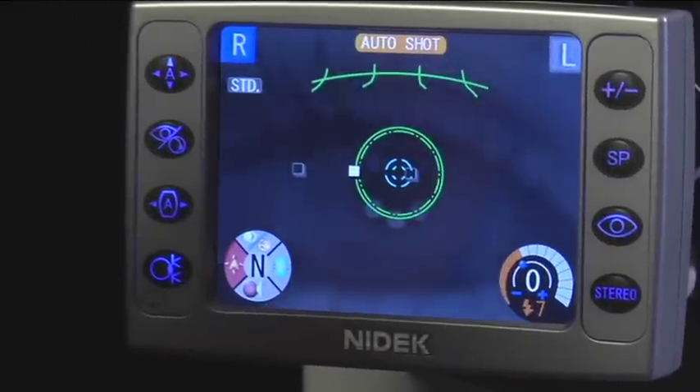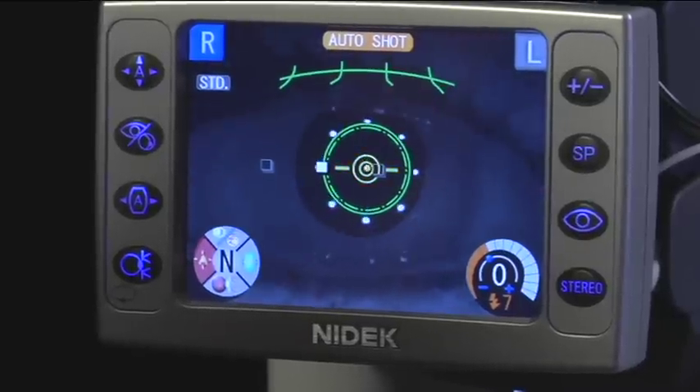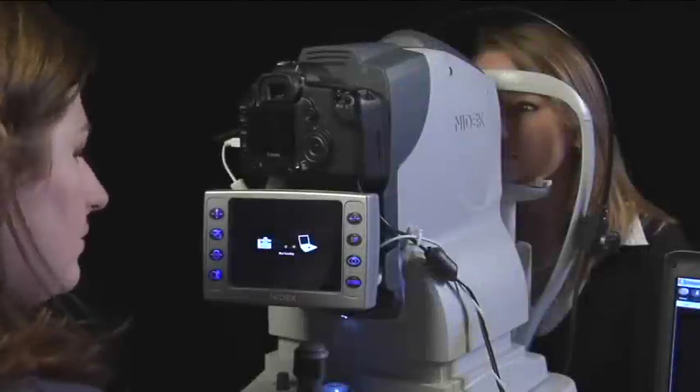If your AFC has auto shot, then follow the prompts on the LCD screen. Verbally instruct the patient to close, then open their eyes. The AFC will automatically capture the image.